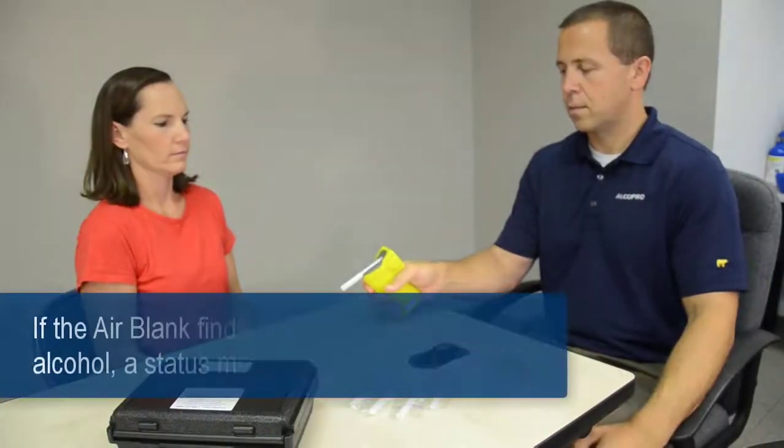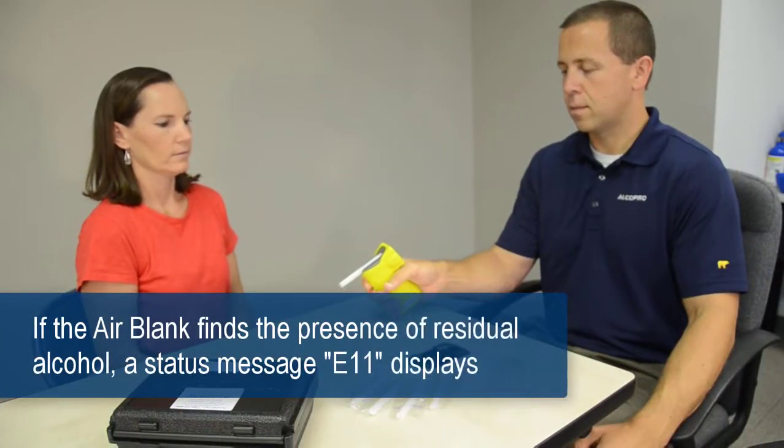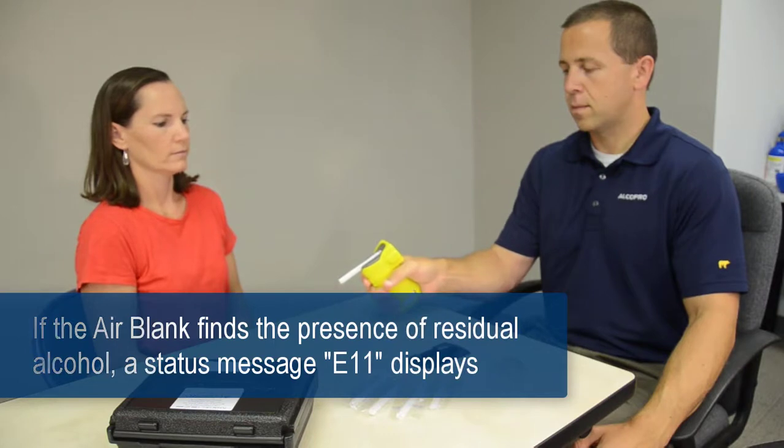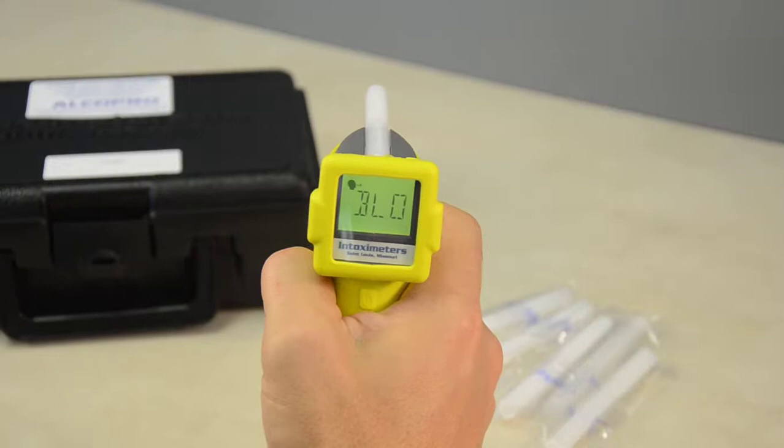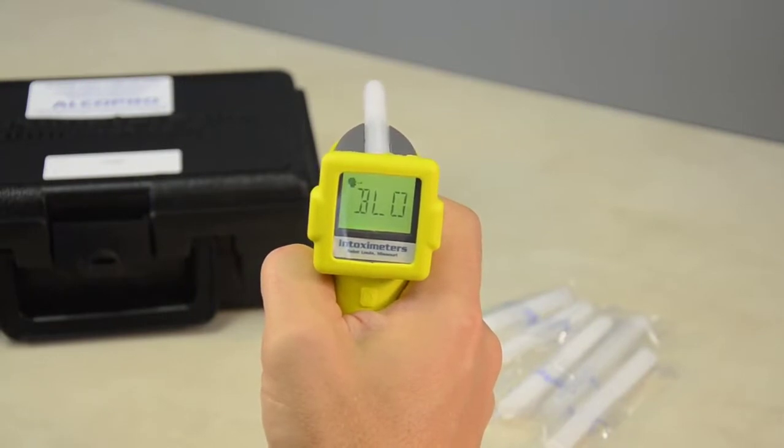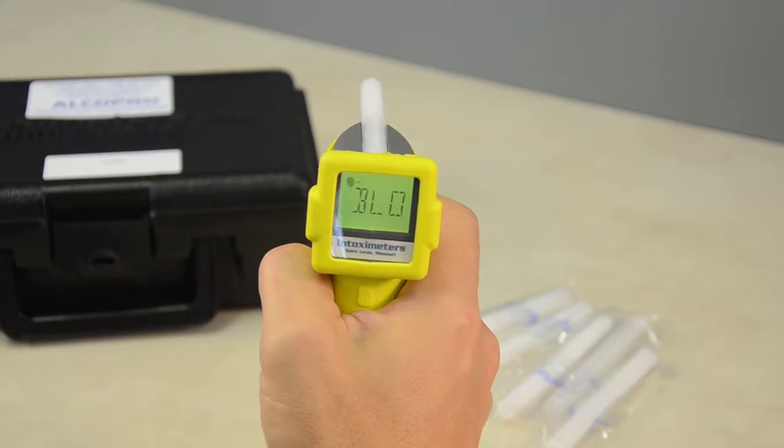If the airblank finds the presence of residual alcohol, a status message of E11 displays and the test sequence is aborted. Next, the display shows the icon of a person's head flashing, and BLO displays. This indicates the device is ready for a breath sample.